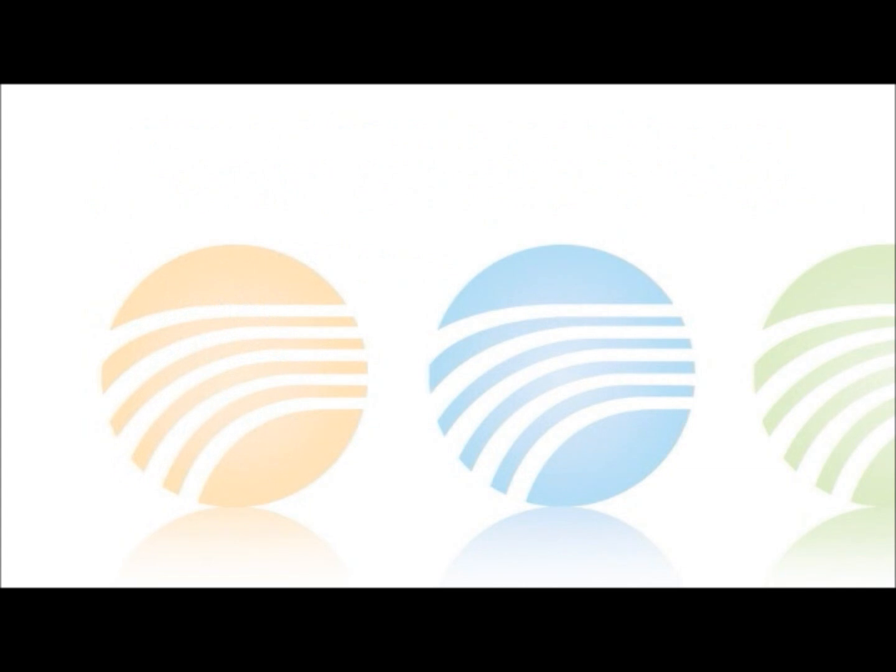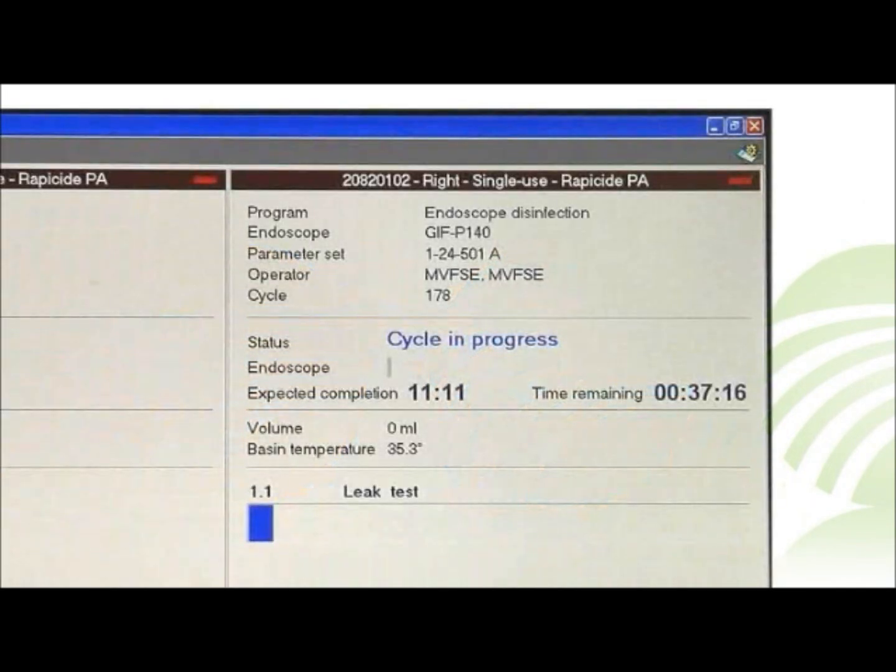The progress of the reprocessing cycle is presented on the user screen. Find the endoscope number, operator ID, and cycle number for that basin. Status, expected completion, time remaining, and phase are noted next.